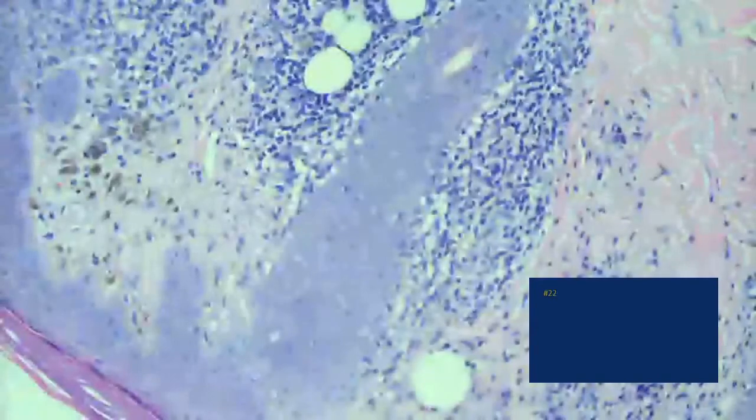Dr. Cockerell, are those adipocytes up high, or are those histiocytes? No, those are adipocytes. That's been studied in the literature. Some people think it's kind of fatty metaplasia. We see that quite a bit. In DLE? No, just in general. It's not specific for DLE. It's just an ancillary finding, and I don't know why it happens. It's actually pretty uncommon, to be honest with you.